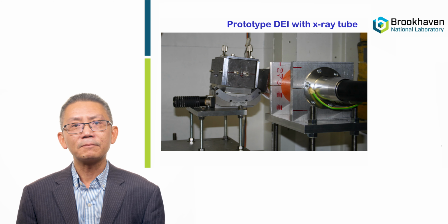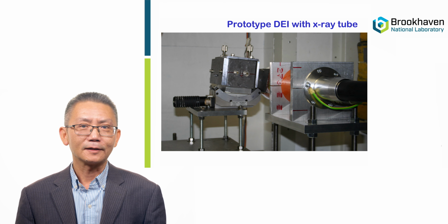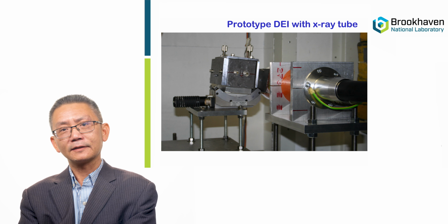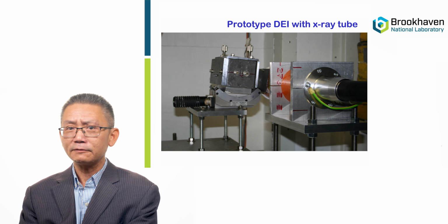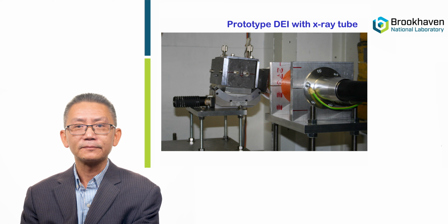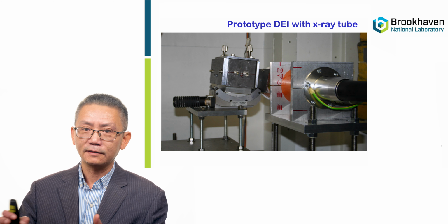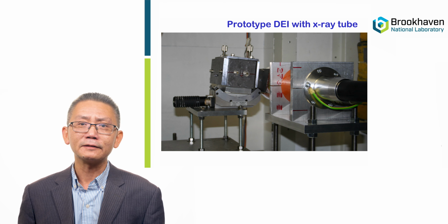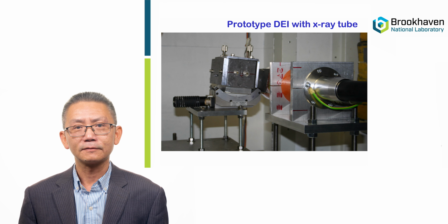We didn't just stop at the synchrotron, because I love synchrotrons all my life. I do experiments with synchrotrons. The radiologists loved our pictures. But then they said, hey, we can't afford to send millions of patients to a synchrotron. That just will not work. So I told them, well, the principle of just converting angle to intensity is the same, regardless of whether you have a synchrotron or an X-ray tube as a source.